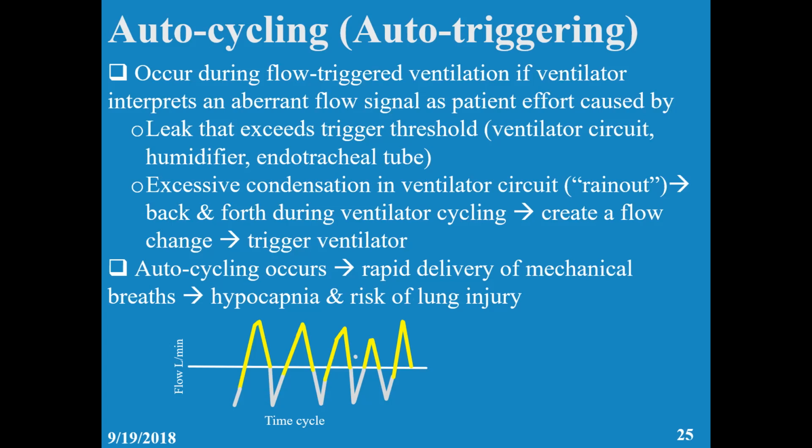Now this will never happen when you are time cycled. No, it will happen in time cycle. Sorry, it will happen in time cycle too.